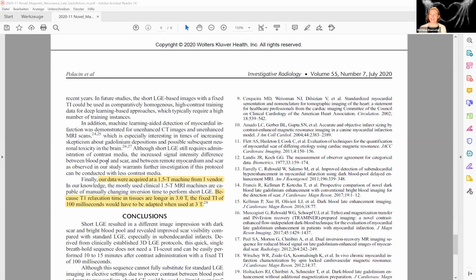Okay, thanks. Matthias has a question, or more a comment. I'm very happy and congratulate you for the study. In fact, we published a paper a couple of years ago from Calgary, Anna Chiara Aldrovandi is the first author, where we also used short and long inversion times. We saw that subendocardial infarcts, but especially papillary muscle infarcts, were almost invisible in the regular LGE, but were very well visible using a short inversion time.